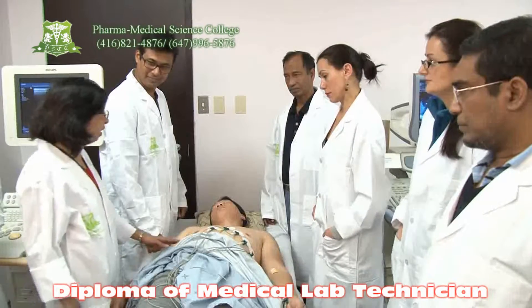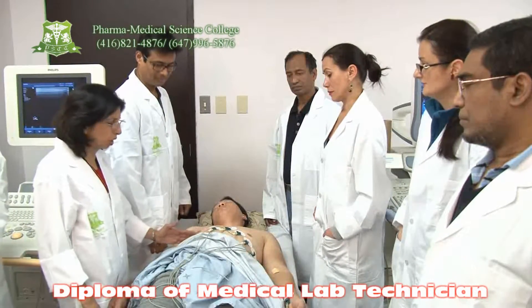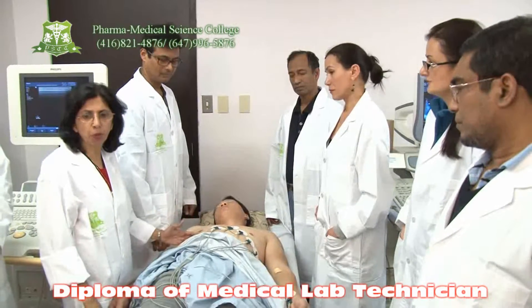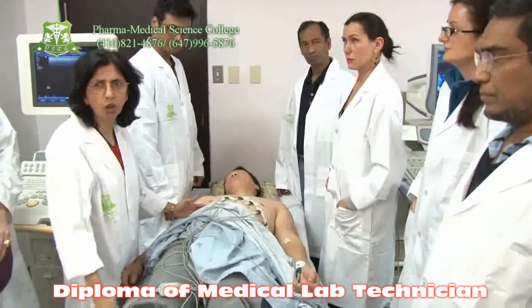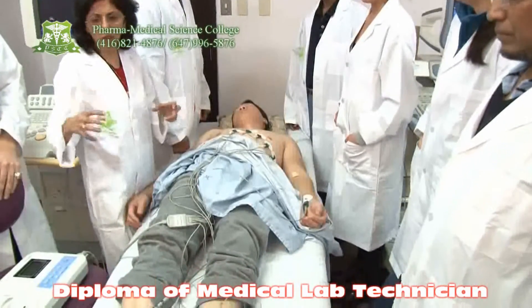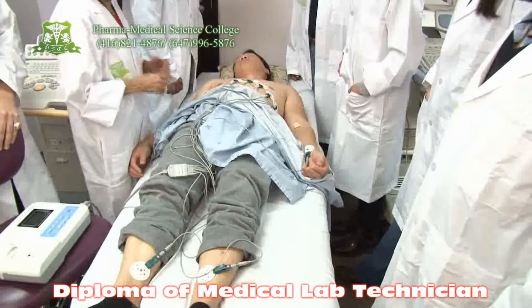Hi, I have a patient here for ECG. In the beginning we have to instruct the patient to undress up to the waist so that the chest will be exposed, and he has to roll up the socks or the pants because we have to put the electrodes on the thicker, massy area of the legs. Now we are going to put the leads.